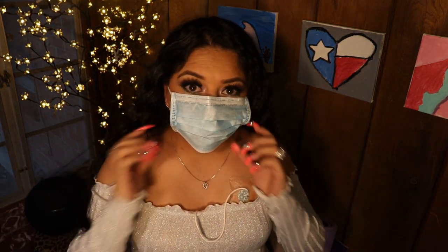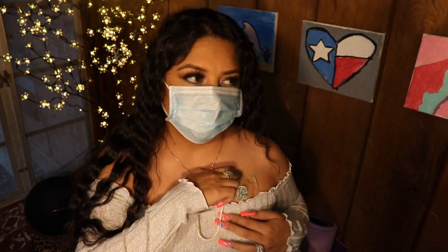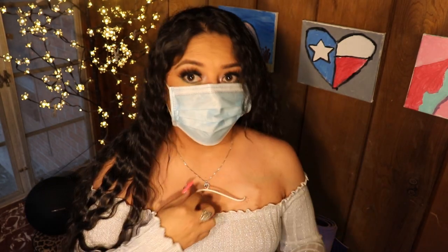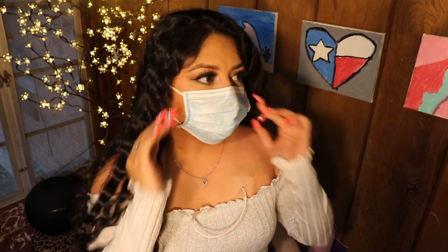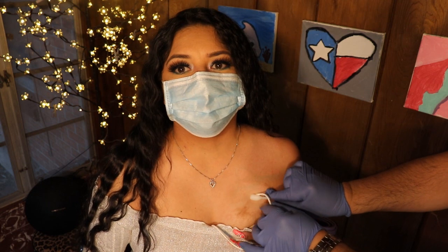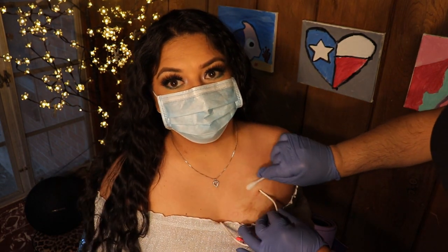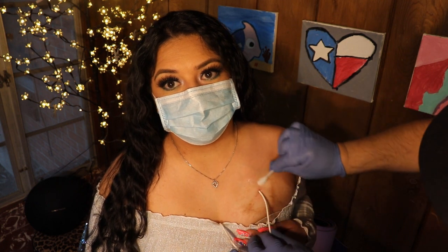Okay, now that I look like Michael Jackson, I hope you can see me and hear me. Here it is — that's my patch. So I'm going to hold this down right here. We first start with the alcohol and you get everything out that you can possibly get out. You push down really hard and you go around.